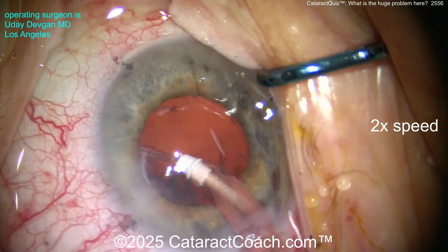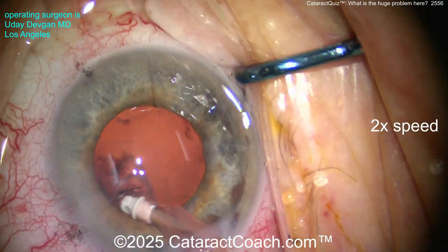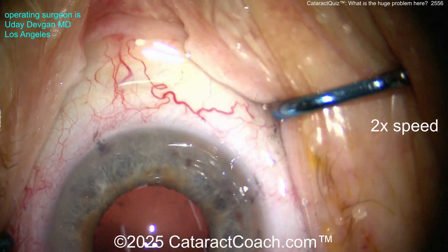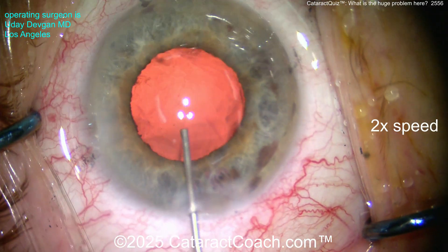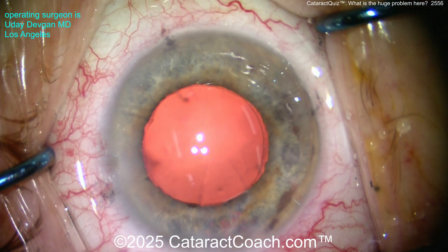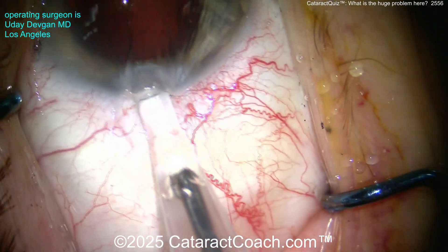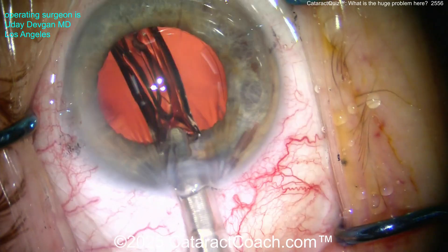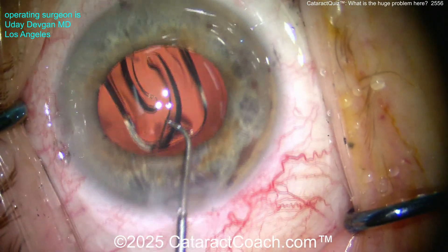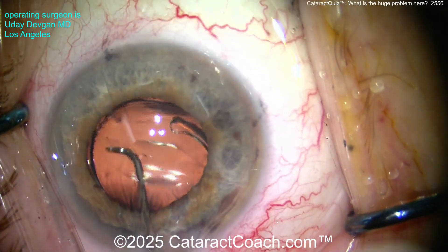Back to the case — nucleus is out, cortex is all cleaned up, everything looks pretty good. The patient has some Flomax, so not the best dilation, but it looks okay. Here's the viscoelastic filling up the capsule bag with a cohesive viscoelastic. The bag looks intact, there's a beautiful intact capsulorhexis. Now we're putting the lens in through a 2.2 or 2.4 millimeter incision — a single-piece extended depth of focus lens with toricity, so a toric version. Getting the haptics open.